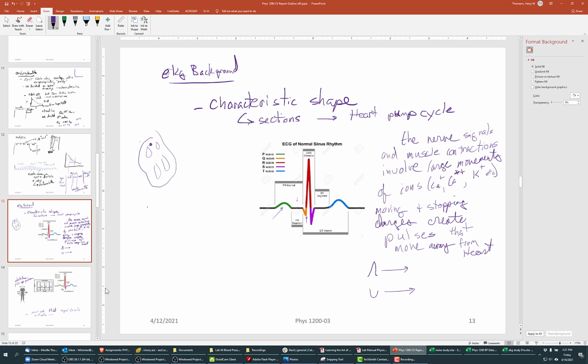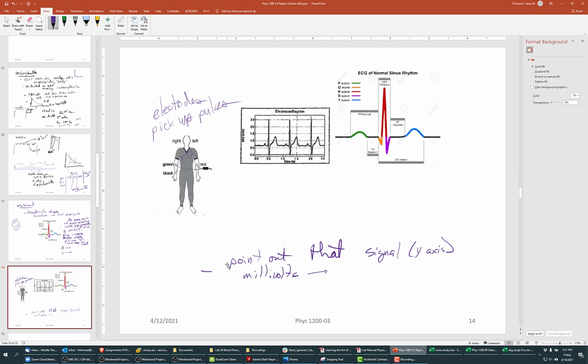And so not only do you say, okay, there's a pulse, it travels in time, it travels away from the heart. So you get this moving pulse of voltage, and then these electrodes pick it up. And the time part comes in, because let's see, what would come earlier in time? Good question. What comes first?